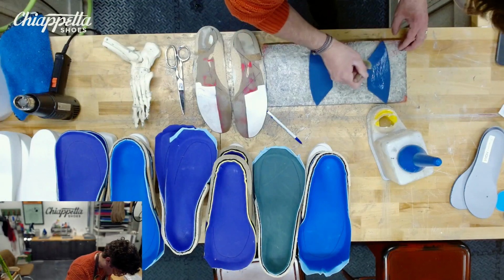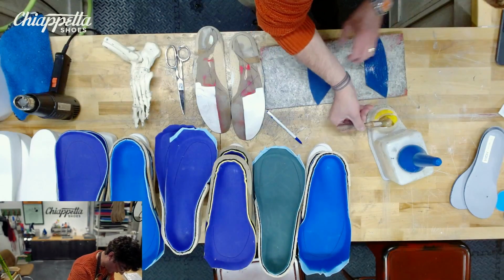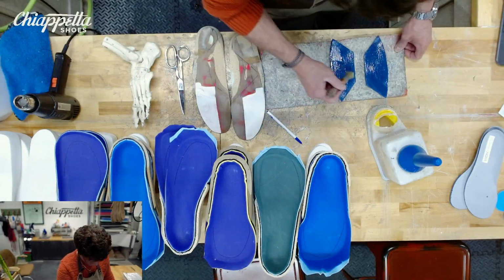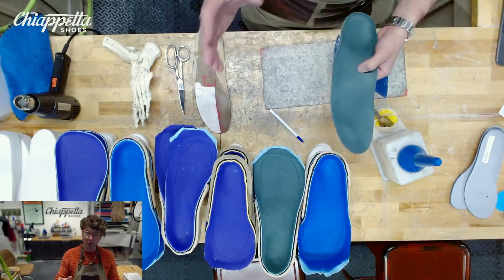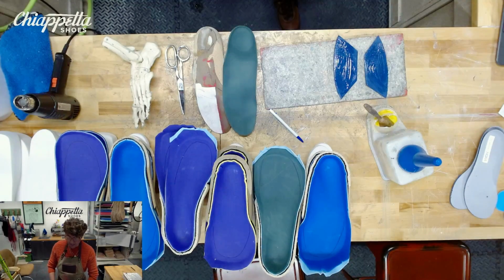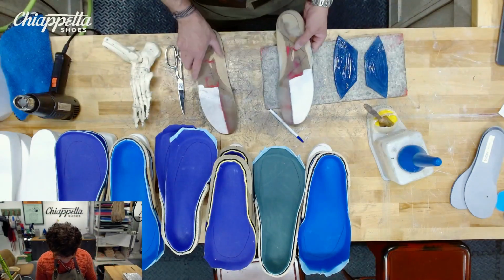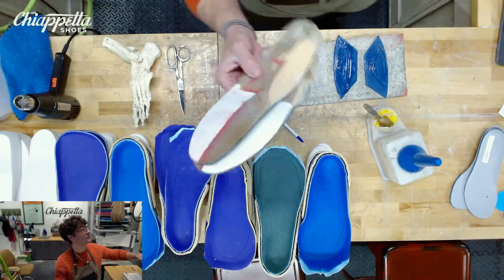So, again, to recap, foot mechanics: A5 foot type, small to mild forefoot valgus, 5 to 10 degrees, extra large rear foot varus. It's a heavy supinator, and had worn orthotics before. Wearing these was creating a medial strain and pain at the bottom of the knee, medial aspect. I think we had the lateral support where we were just putting too much internal rotation on the foot. So we're softening things up, still getting the shape and contour without overdoing it. I'm going to take these over to the grinder real quick.